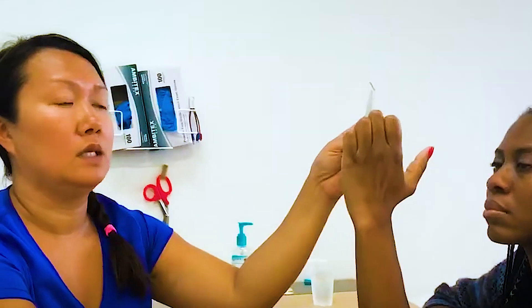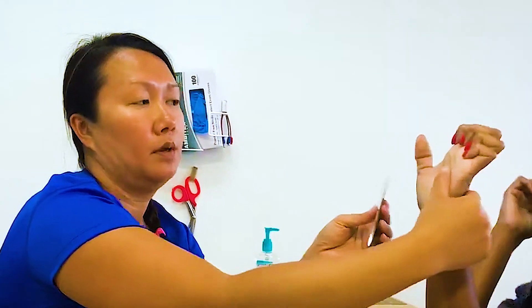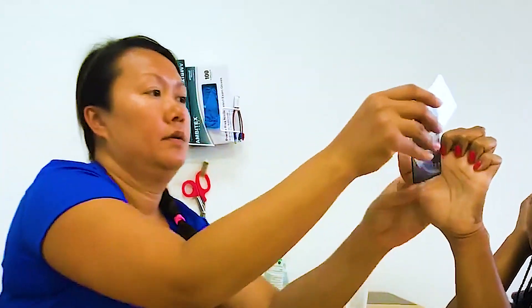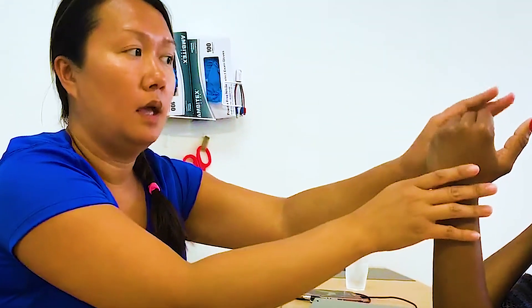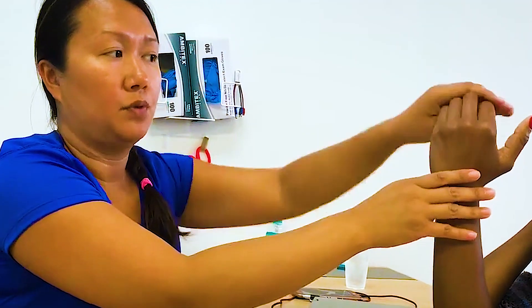The reason why you do your IPs this way is so that you can get to your DIP. You can't get to your DIP if your fingers are like this — it's extremely hard. So I always measure the DIP with a hook fist. Now, if somebody has a certain type of tightness, you can write that too. So if they have IP, but when they flex because of extensor tendon tightness, they can't flex their IPs when their MPs are down — you just have to notate that.